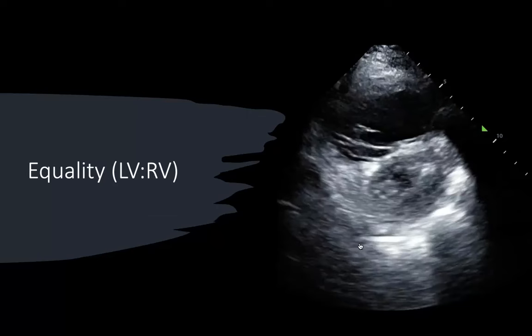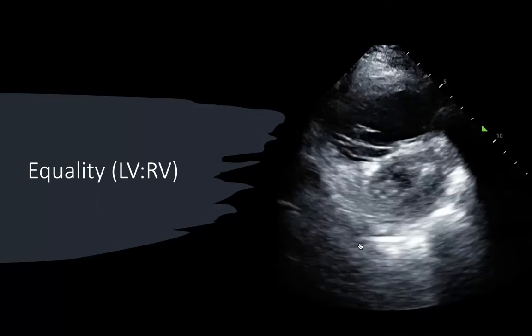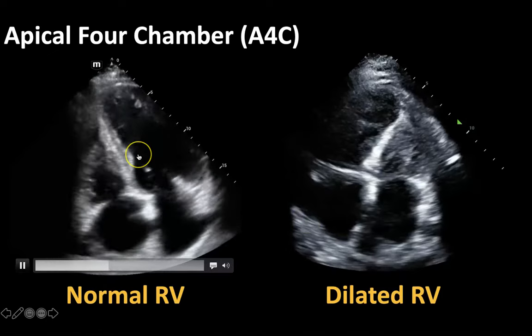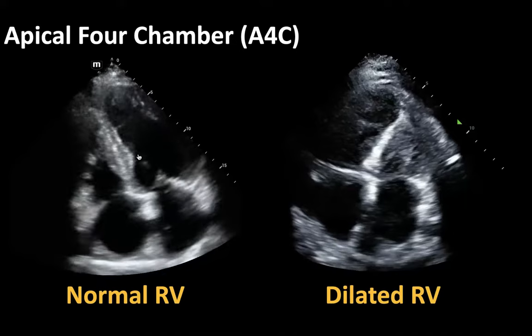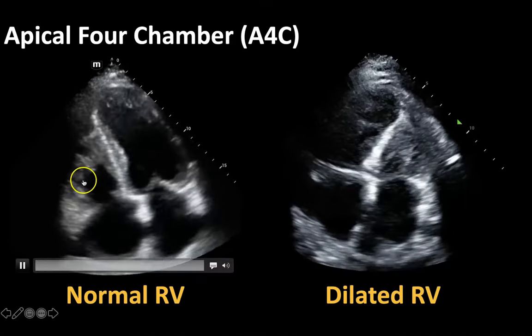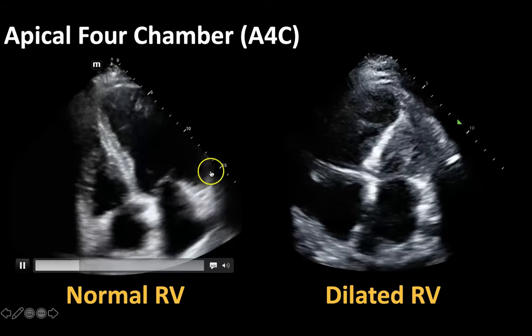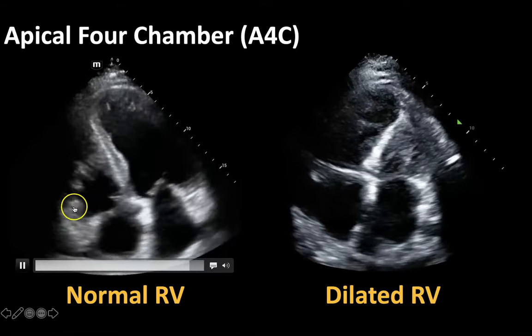So lastly let's assess for equality. Equality is really about comparing the left and right ventricles. Normally your left ventricle should be larger than your right ventricle. Your right ventricle should be about 60% of what your left ventricle is in cross-section, measured at the level of the valves.